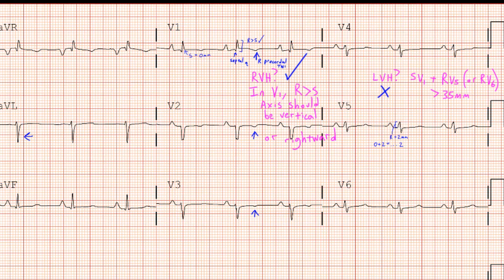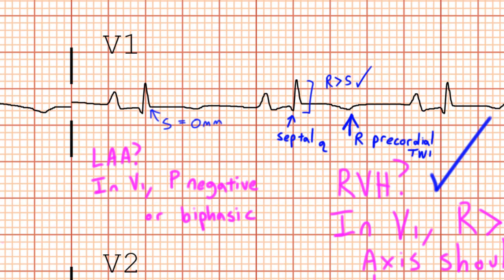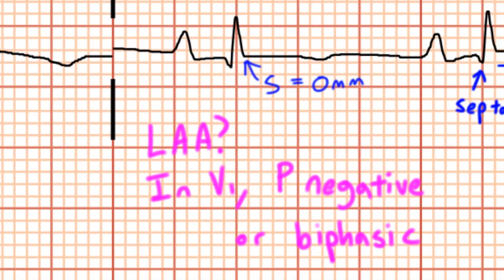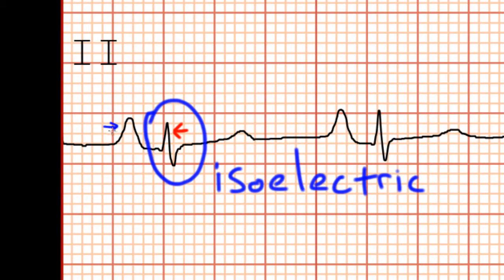Now let's look for signs of left atrial abnormality. For left atrial abnormality, we look in lead V1 for a P-wave that's negative or biphasic. Looking here in V1, we can see that this P-wave is generally pretty positive, and if there's any negative deflection at the end, it's pretty small — definitely not more than one small box in area under the curve. We can also eyeball lead 2 and see that these P-waves are not broad, so we don't have any signs of left atrial abnormality here.